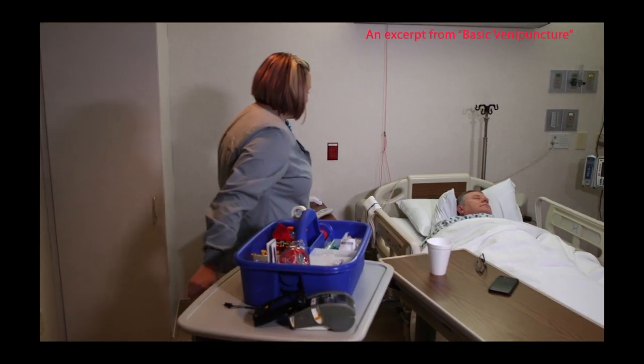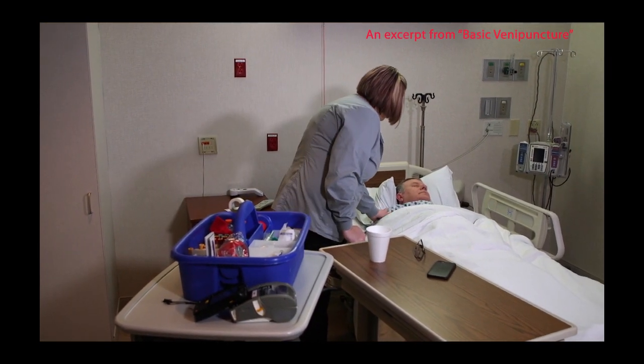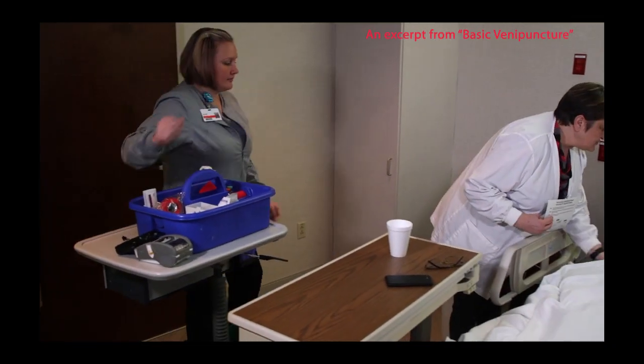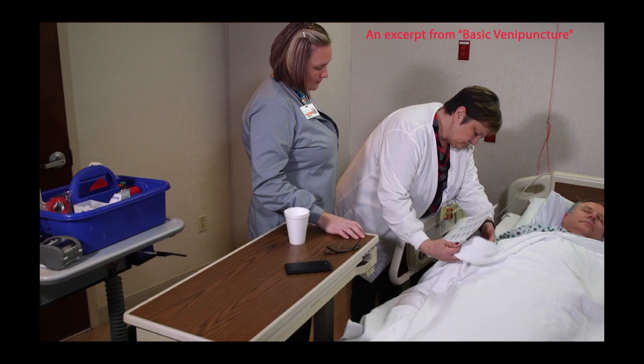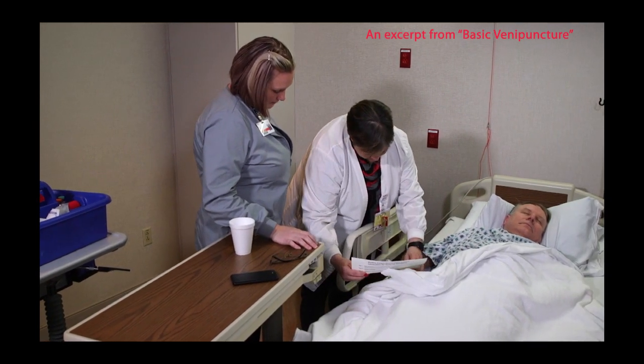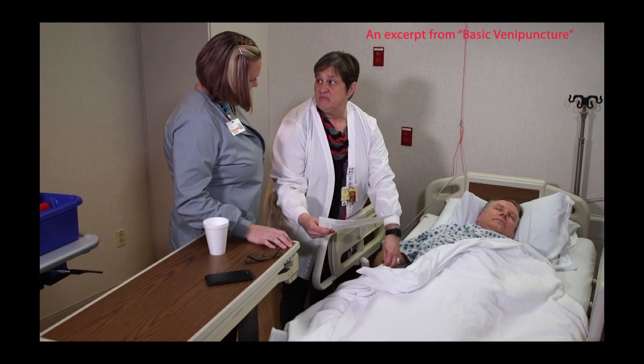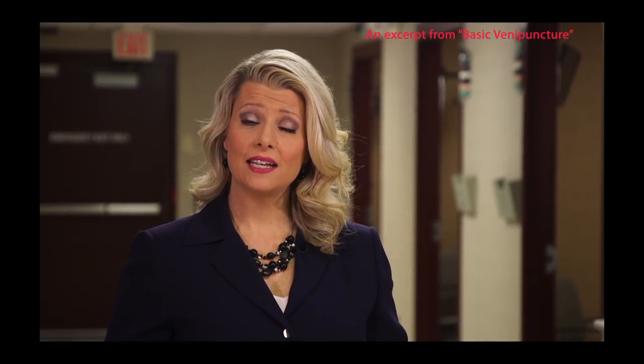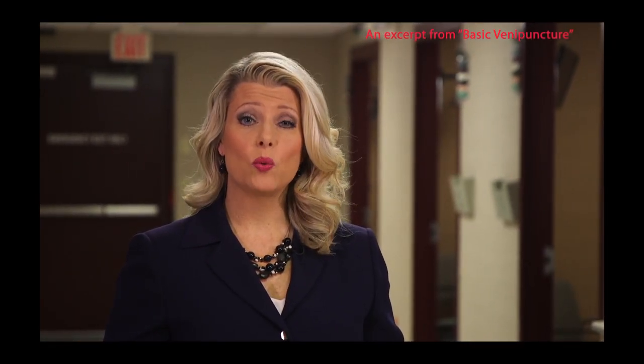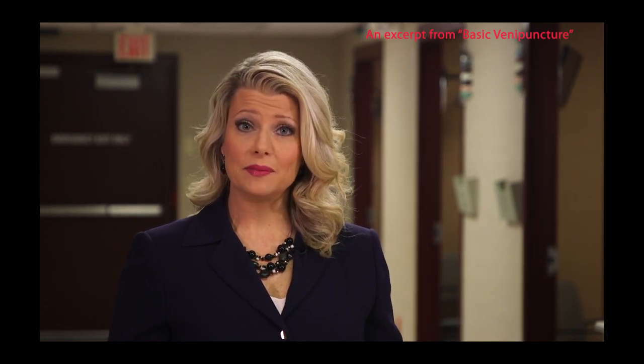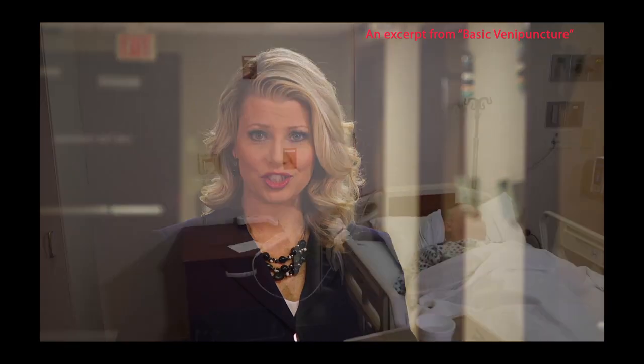For patients who are unconscious, sedated, cognitively impaired, or have other communication or language barriers, a family member, friend, or another caregiver who is familiar with the patient must be asked to provide the same information on the patient's behalf. When a third party identifies the patient, the standards require we document the name of the identifier. Any discrepancy must be resolved and corrected prior to sample collection.